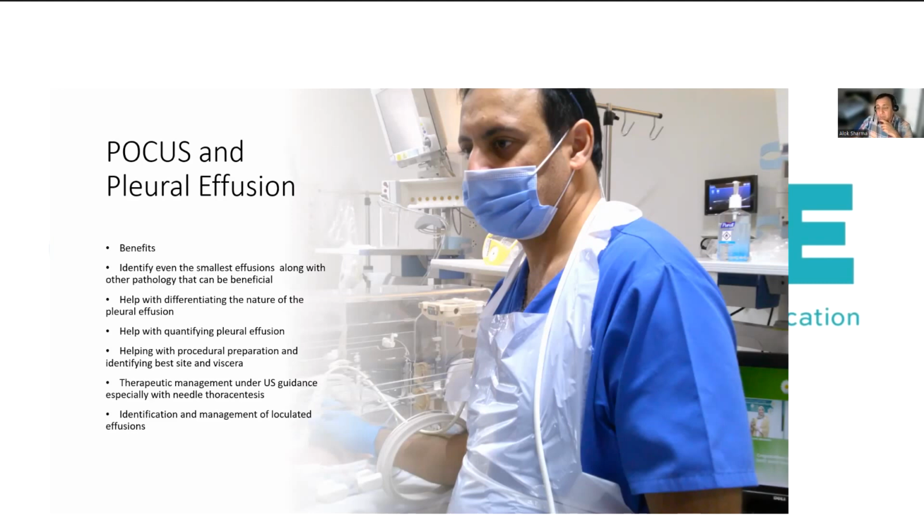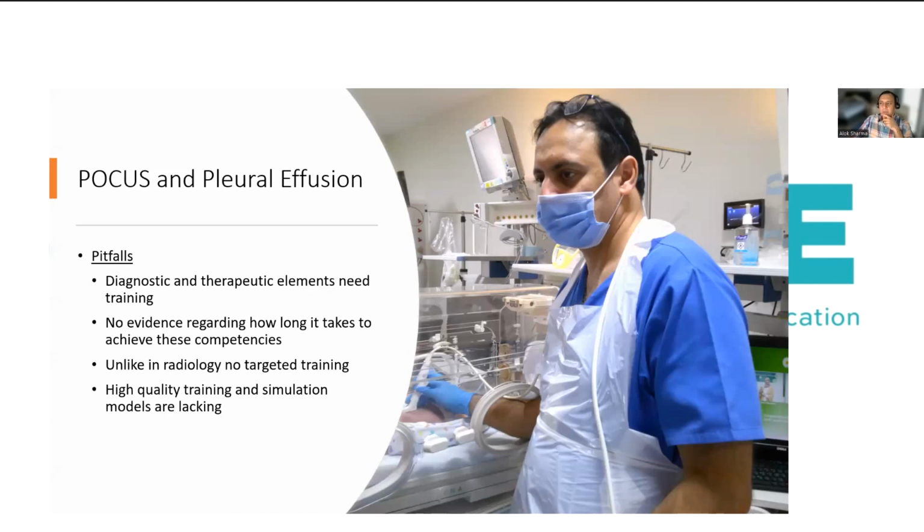And again, I've been in a situation in my neonatal unit in Southampton where I've put a chest drain in for landmark-based pleural drainage, where I've been unable to get the amount of fluid which I clinically thought I would. But getting an ultrasound done helped me identify a loculated pleural effusion with the maximum loculation superior to the area that I was going. It allowed us to localize our drainage to that particular area. So I think without a doubt, point-of-care ultrasound has benefits. There are some pitfalls that you need to be aware of.